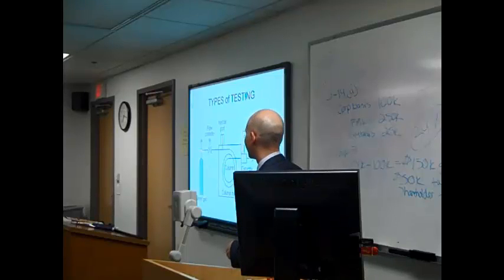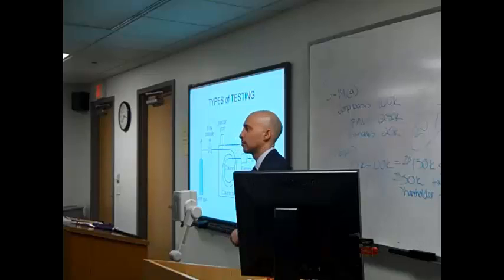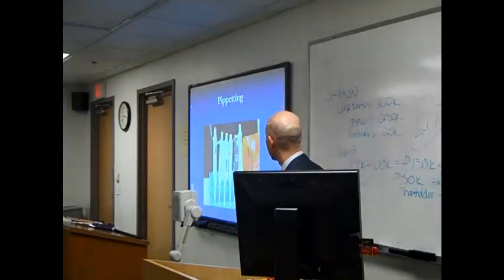Carrier gas is just briefly, what's used is typically helium or nitrogen. It's inert, so it's not going to interfere with the testing process.